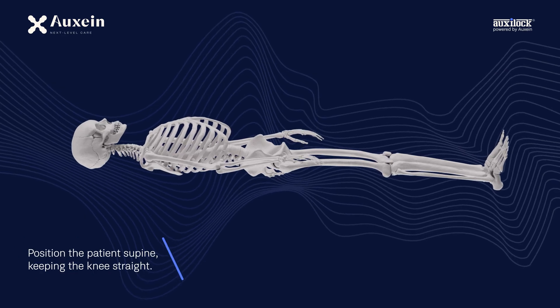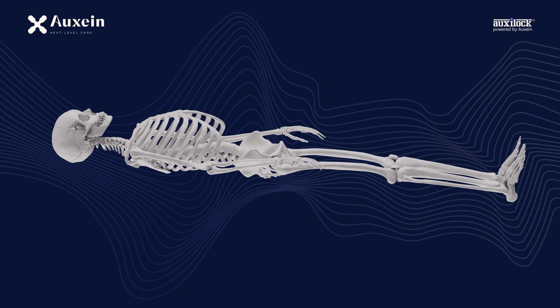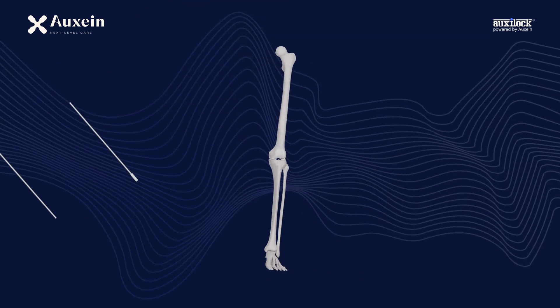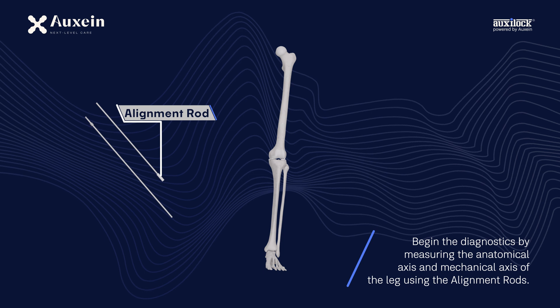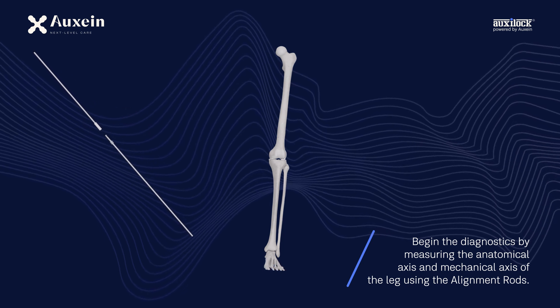Position the patient supine, keeping the knee straight. Begin the diagnostics by measuring the anatomical axis and mechanical axis of the leg using the alignment rods.